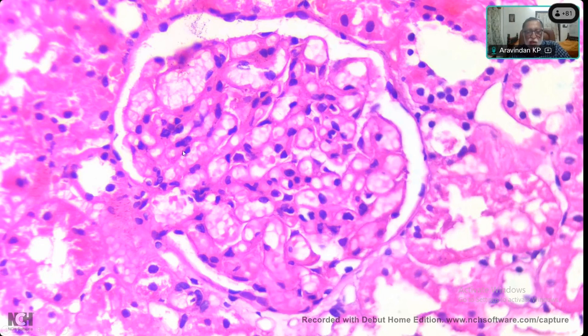So thickening is what you suspect. Of course, we have got to confirm with other means. What is the other point that you would like to make in this biopsy? So, in this biopsy, we can't identify any cellular proliferation in the glomerulus. Exactly. So, the number of cells is not increased. Yes, that's another picture. When do you say that the number of cells is increased?